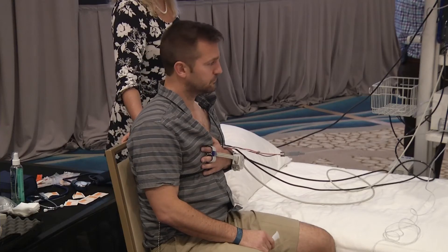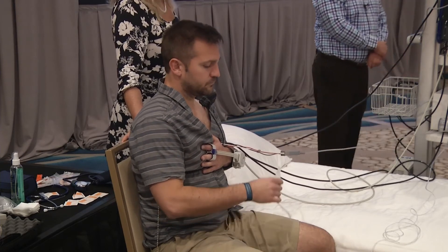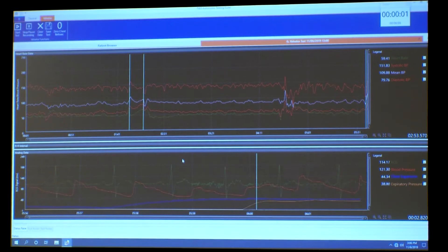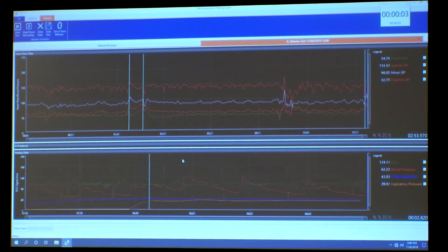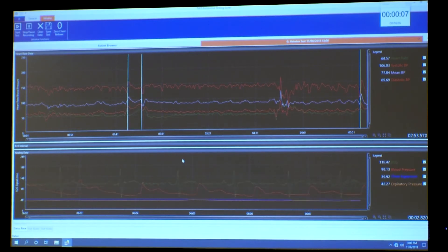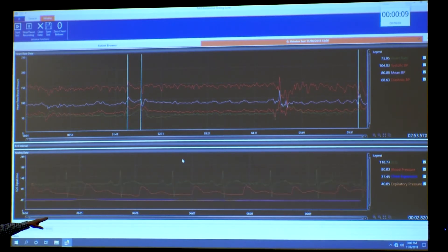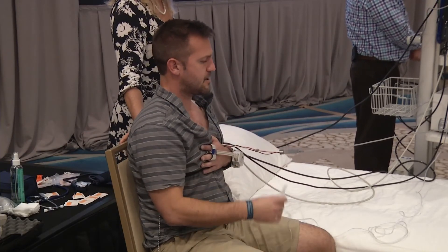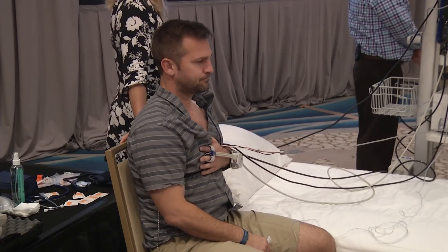Okay, nice one — nice big deep breath and blow it up to that 40. For those on screen, at the bottom you can see where the pressure is at 40. And stop, just relax — we're monitoring your blood pressure for the next couple of minutes.